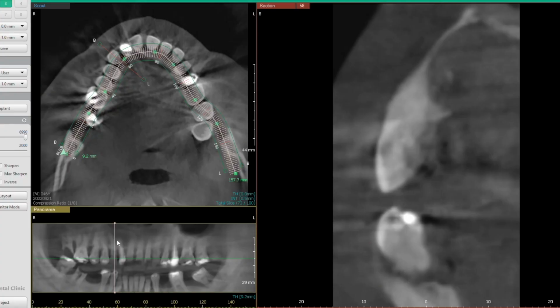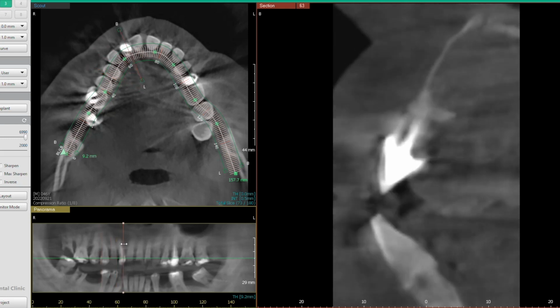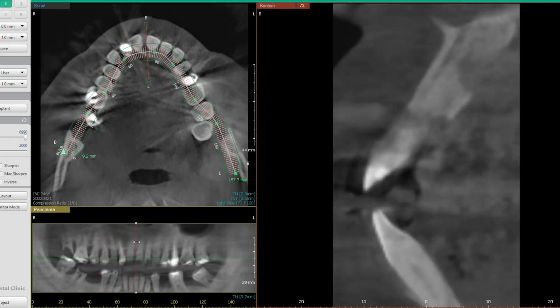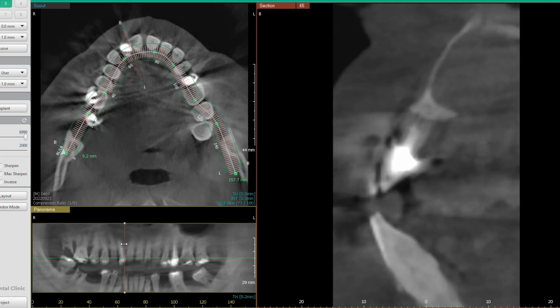And the same thing actually goes with the dental implants. Again, with an all-on-4, we want to spread those implants equidistantly. Now, the issue with him is that where we wanted to place those implants, you could see from this whole area, which is right between his first and second premolar, all the way to his front central incisor on the right side, tooth number 8, that's all infection. And we want to definitely stick an implant there. And so that's going to pose a little bit of a problem.